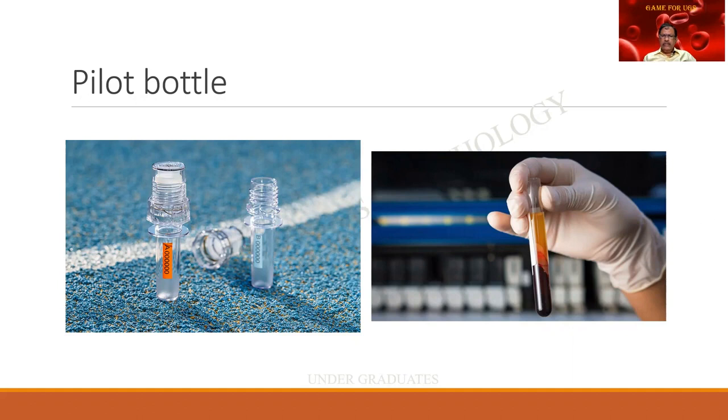Not uncommonly, we find some kind of a transfusion reaction once the blood is started being transfused. And we do not know whether it is a wrong blood group or whether there is some mistake in it. So we rush to this pilot bottle, take it, and recheck the blood. Also, we'll be having the patient's blood with which we do a cross matching and find out that it is compatible. So this is the importance of the pilot bottle. Without it, we will be landing ourselves and the patient in a catastrophe.